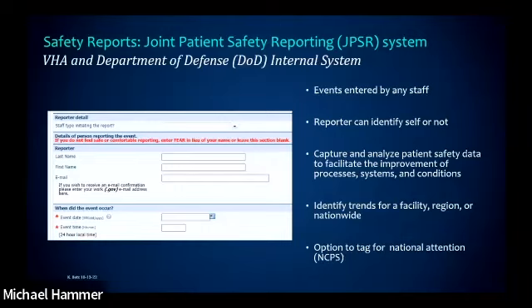And if there's a concern that this issue extends beyond my facility, they can mark that for national attention. And then that's where my office at the national level receives that information and says, this could be a problem for other professionals in our system or for other veterans that we take care of. And then we have mechanisms of communicating that concern when appropriate with the rest of the country. And so if we see an issue with any type of medical device, if we see an issue where this occurred with a manual wheelchair, and we know that we've purchased X thousands of those manual wheelchairs, we now have 6 reports of different things, we're thinking this is a bigger issue, and we're going to take action to communicate with the manufacturer, communicate with the FDA, get the information out to the field. Again, not to be punitive, but to provide awareness that this might be an issue and we have an action to prevent people from getting hurt.